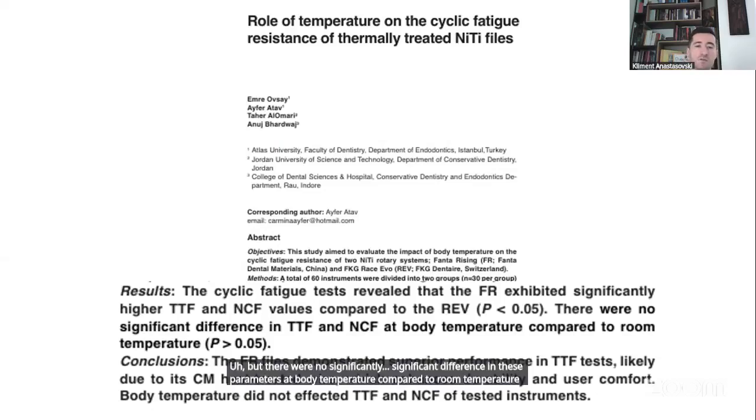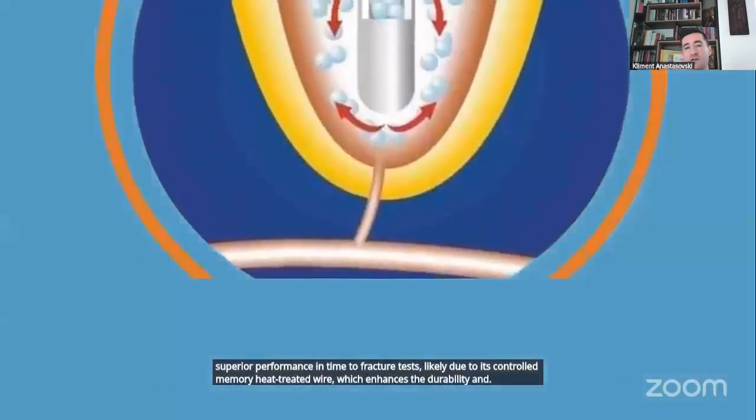They concluded from this that the rising file system demonstrated superior performance in time to fracture tests, likely due to its controlled memory heat-treated wire, which enhances the durability and user comfort.